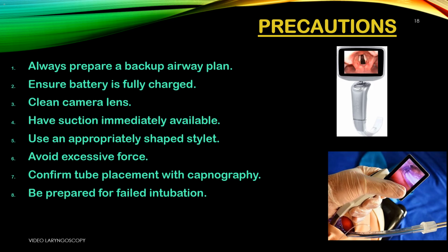4. Have suction immediately available. Blood and secretions can block the view in seconds. Suction keeps the airway clear. 5. Use an appropriately shaped stylet. Match the stylet curve to the blade. Helps guide the tube into the glottis smoothly.